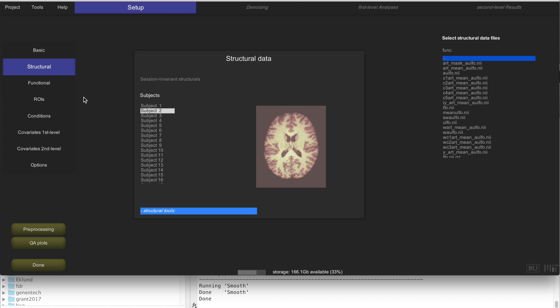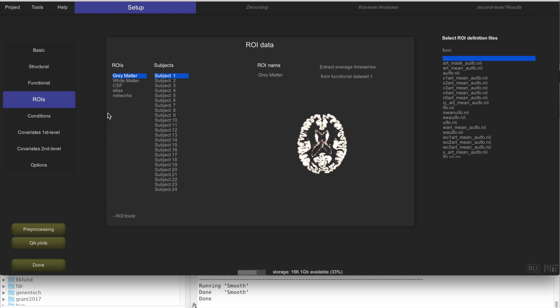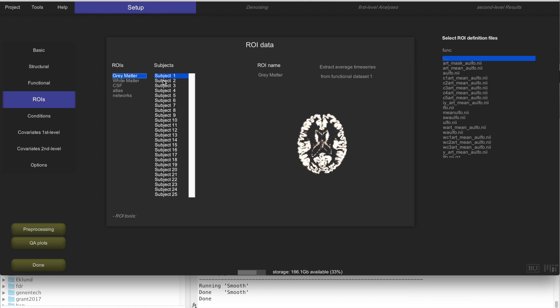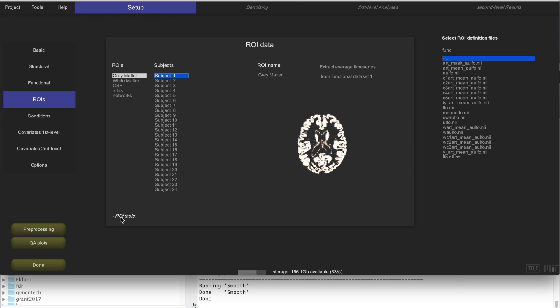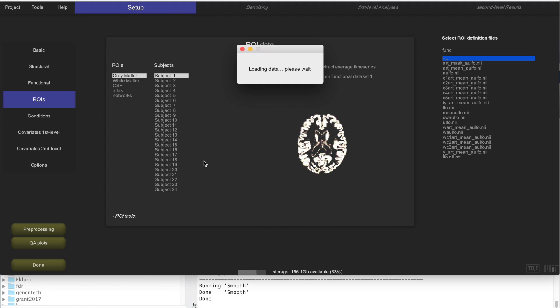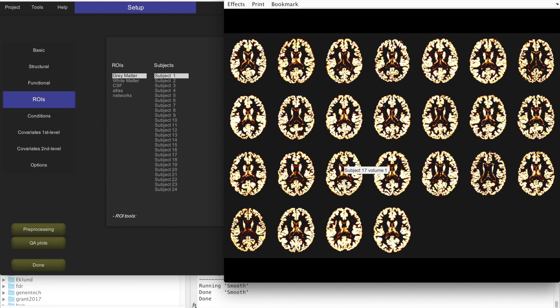In addition to normalizing and correcting for motion from the structural and functional data, there are three other sources of information that have been added to your CONN project automatically by the preprocessing step. The first is ROIs — CONN has created three ROIs for you: grey matter, white matter, and CSF, containing these three tissue classes for each subject. This is a mask of grey matter voxels for subject 1, 2, 3, all created by the segmentation step.